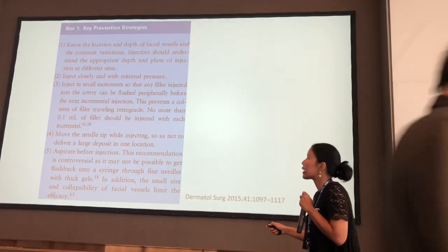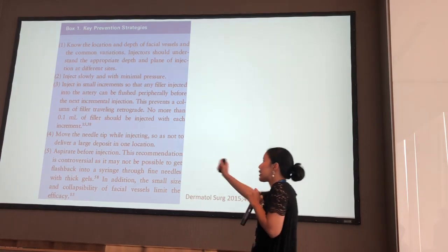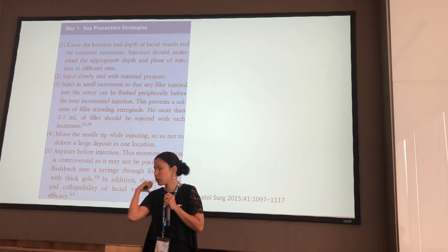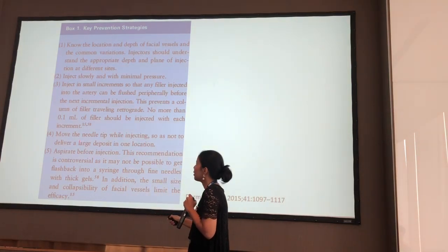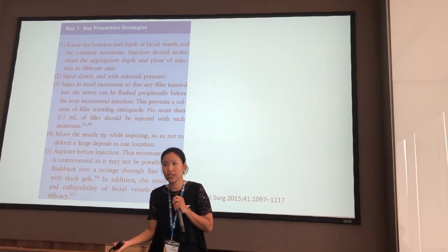And you have to inject slowly with the minimum pressure. And inject in small increments, one by one. Do not push a big bolus. It's too risky. And aspirate before the injection. It does help, okay? Although it's not 100%, it does help.